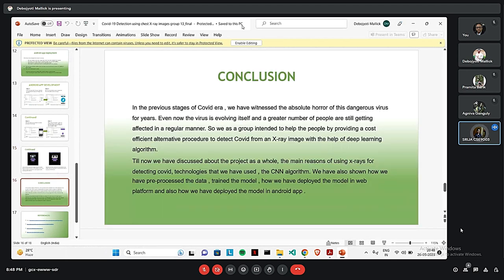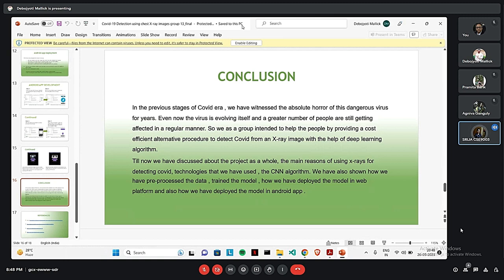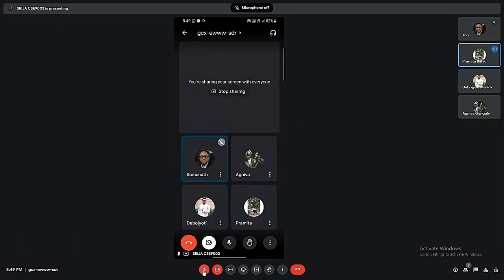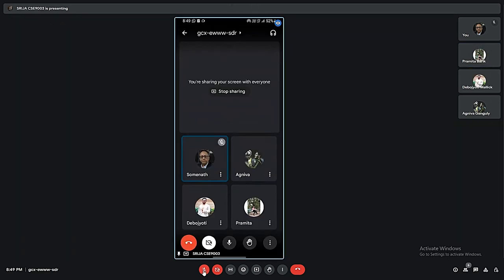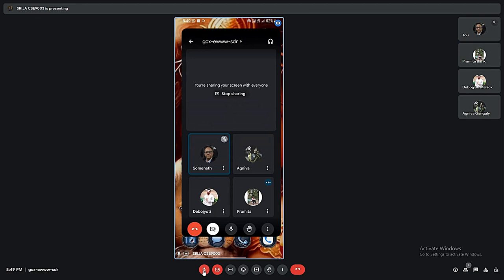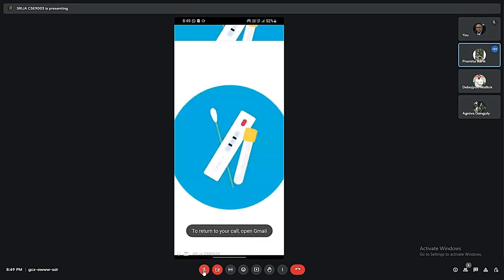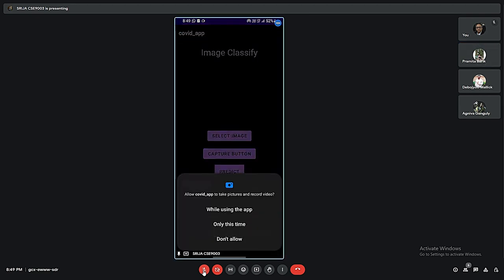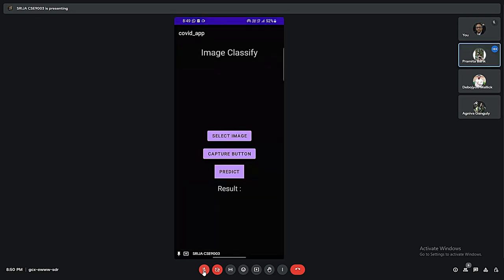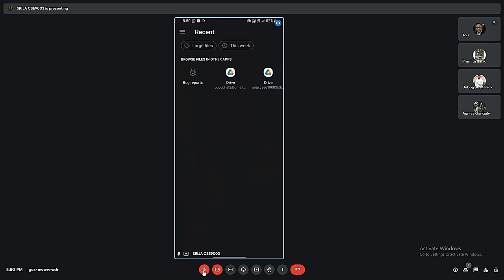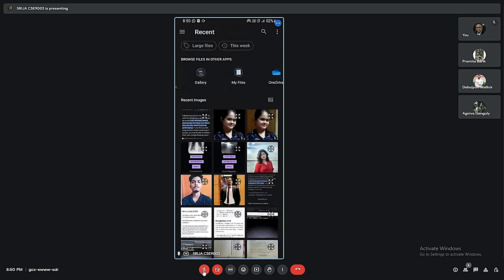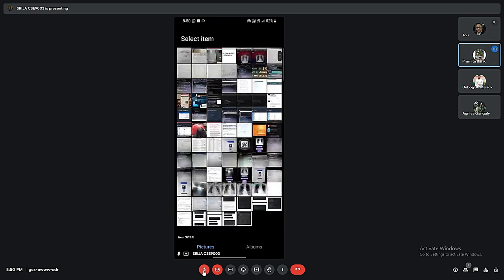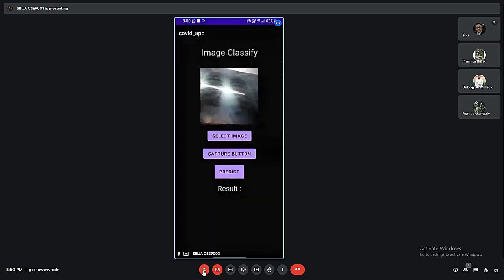Lastly, we have come to the conclusion. In the previous stages of COVID era, we have witnessed the absolute horror of this dangerous virus for years. Even now, the virus is evolving itself and a greater number of people are still getting affected in a rampant manner. So, we as a group intend to help the people by providing a fast effective alternative procedure to detect COVID from X-ray images with the help of deep learning algorithm. Let's see our app. This is the logo of our app and upon clicking it, we are getting the flash screen. It asks for the permission. Then, we select the image from our gallery. We have selected a COVID negative image and if we click on predict, it is showing COVID negative.